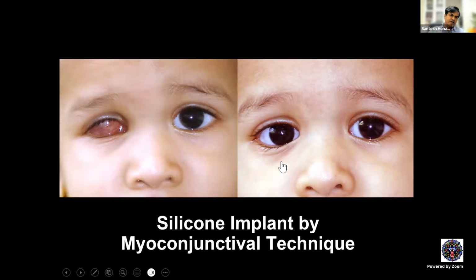and the lateral canthus. You can't truncate the prosthesis. If you truncate the prosthesis, it will fall off or it will get decentered. Truncation of the prosthesis to improve motility is possible only if it is pegged. So the peg will stabilize the prosthesis and you can truncate it.